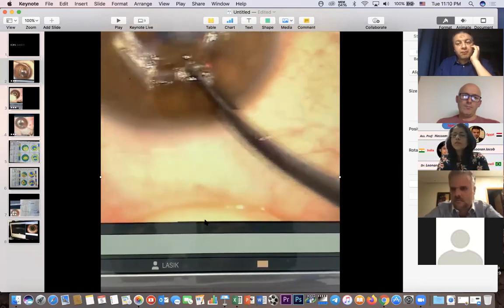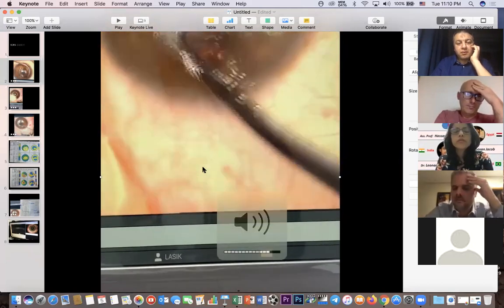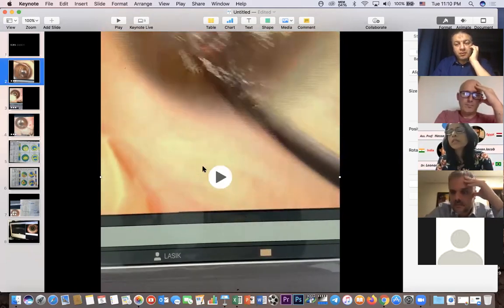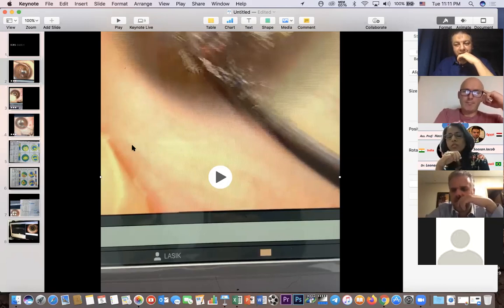Can I say something? Yeah. Please. You know, with femtosecond laser dissected channels, like Leonardo also said, if they're tight channels, and if you're pushing a lot, sometimes because you're pushing either with the manual dissector or with the segment, it can start leaving a false passage, which means it loses the initial femtosecond laser channel and then starts going into a different passage. And then once that happens, you just cannot progress anymore. I had described a technique for handling this with Intacs way before, when I used to be doing it. I think the publication must have been 2010, 2011 or something.